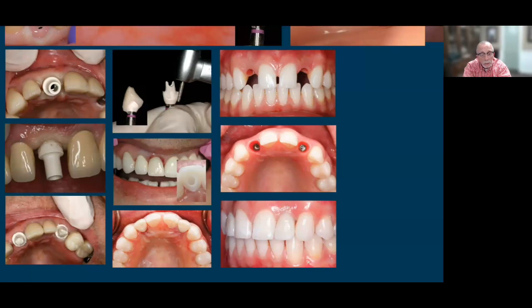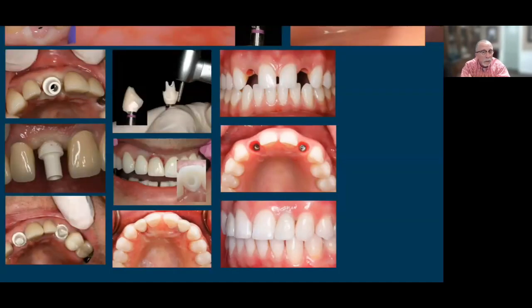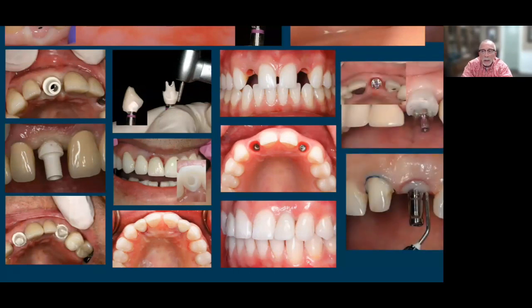The rule of thumb we always used was if we see blanching, right? Like in the upper left picture, if I see that blanching, then I kind of know I'm there. But if the blanching doesn't go away in 2 or 3 or 4 minutes, right, then we're pushing too hard. And so we've got to adjust and adapt. Now, with digital planning for implants, digital planning for the temporary restorations or the final restorations, if the data is good enough, like from a CBCT or a scan, we can know exactly how to engage that tissue, to say that 1/10 of a millimeter. But visually, chairside, the blanching is always a good indicator.